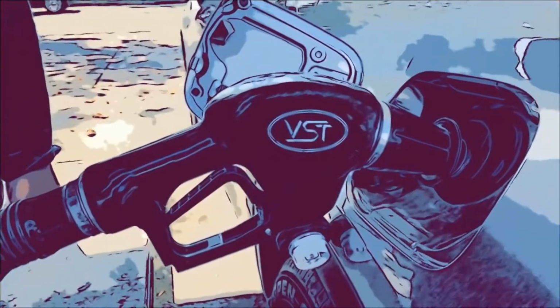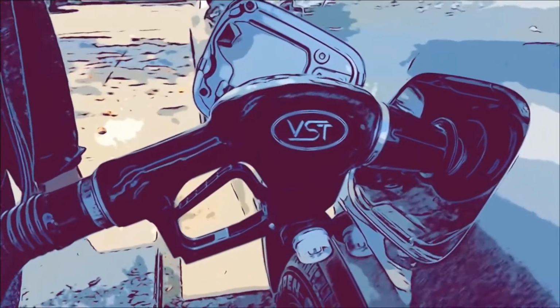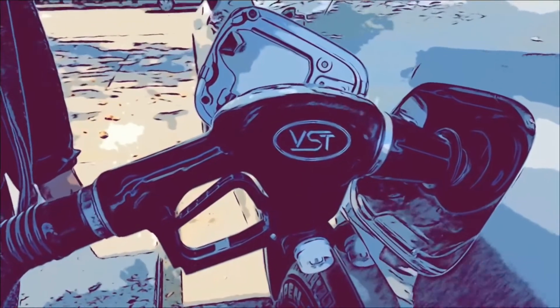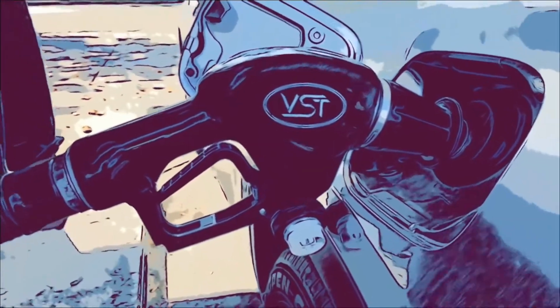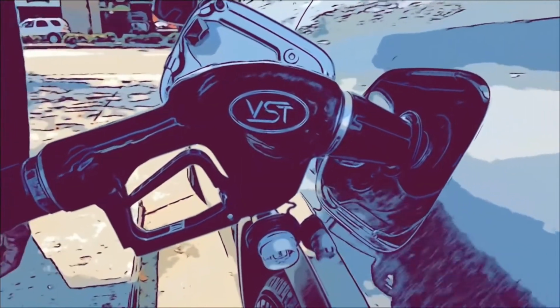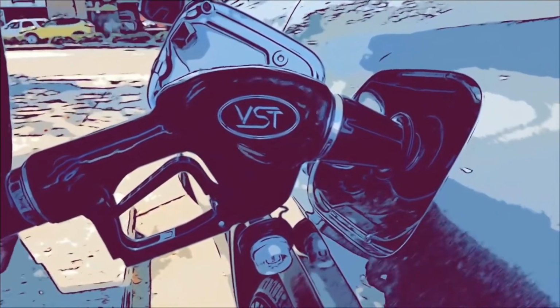So as you see, while we are pumping gas, the pump has a lever that we flick up to start filling our tank. When the tank is completely filled, the auto shutoff will make the lever flick to stop the flow of gas to avoid an under or overflow. The AEC uses the same concept. It also shuts off when there is enough ionization to the image receptor. This helps create an X-ray image that will help with the diagnosis of the patient.